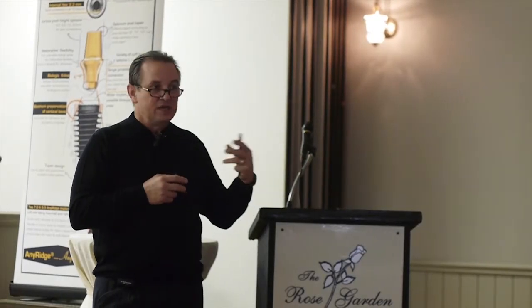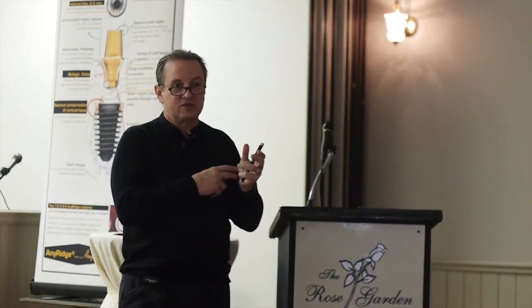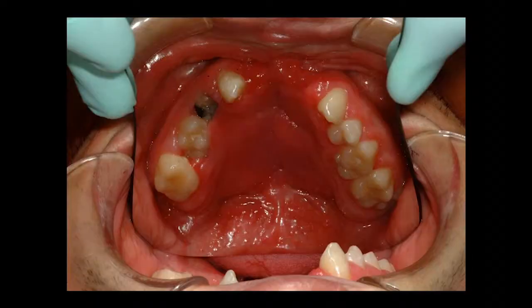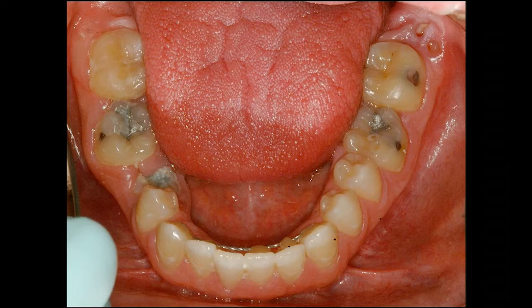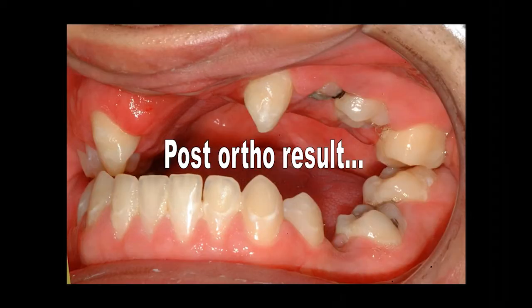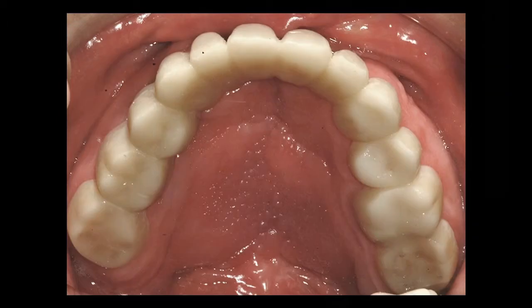I had him wear a snap-on smile. I've made like 4 of those in my life, and he was one of them because this guy's running around with no teeth. He's 17 years old. I said, well, let's try this snap-on thing. Man, he was elated. But after a while, I said, I think we can do better than that. So we got rid of some of this stuff, some problems on the bottom. Here's his post-ortho result. Look at the occlusion. It's just not too hot. Look at this. So I don't know what they were doing in the orthodontic deal, but it didn't really turn out too hot. This is a snap-on smile that he wore for a couple, 3 or 4 years.